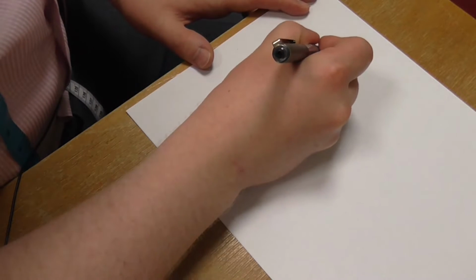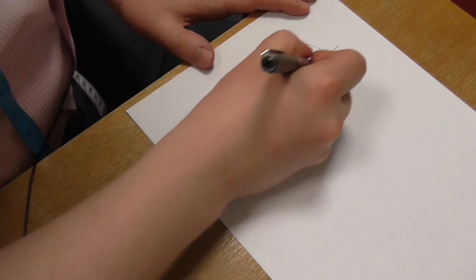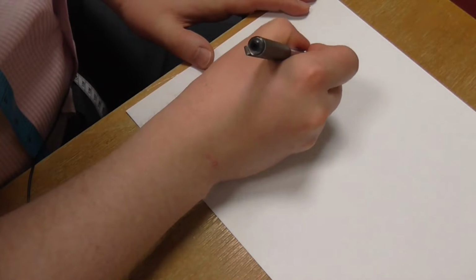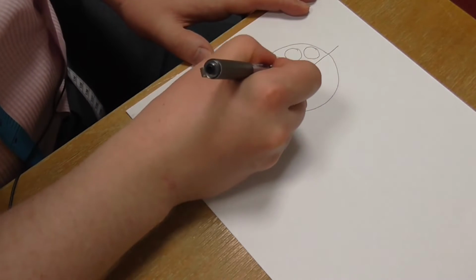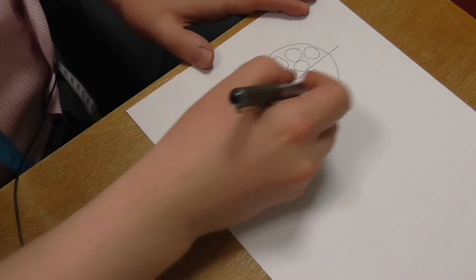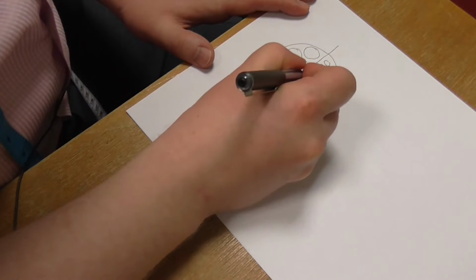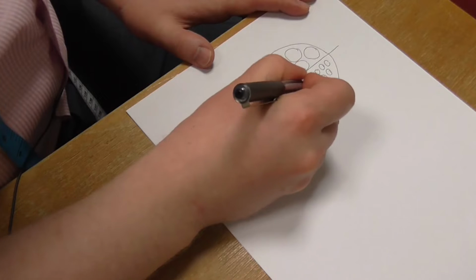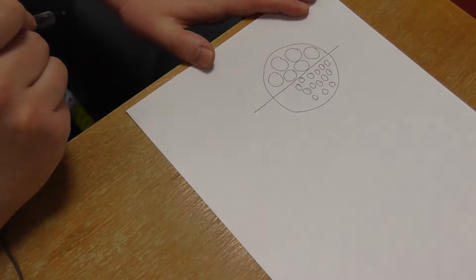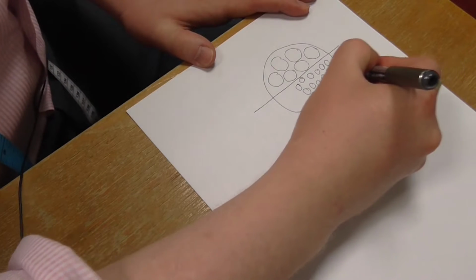In myopathy, the muscle fibres shrink down, and if we just draw this pictorially, imagine this is our field of view. This is the normal side where you've got nice, large, healthy muscle fibres, like so. And on this side, we've got small, shrunken, diseased muscle fibres. Imagine we put our concentric needle electrode over here.